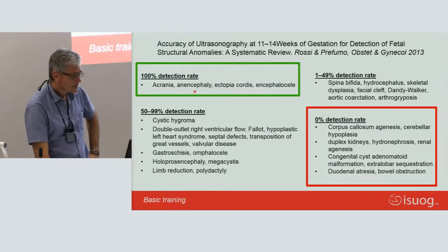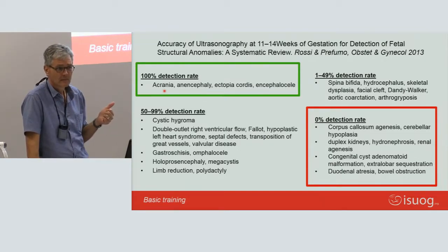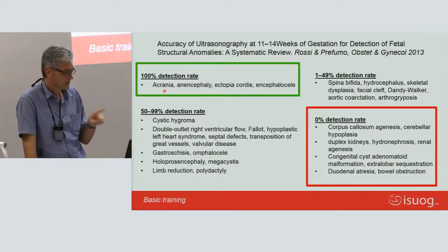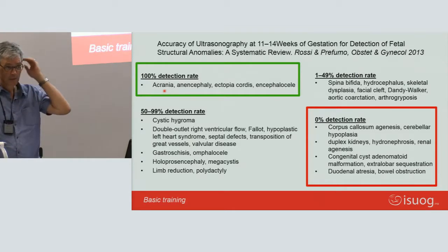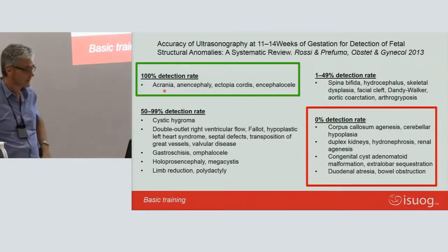And so, acrania, what's acrania? No head. Anencephaly, is that the right term to use now? I'll show you later, but it's not actually the right term for now. But maybe anencephaly is a kind of picture of the term infant, where the skull ends at the base of the skull. So there are eyes, but nothing above it.